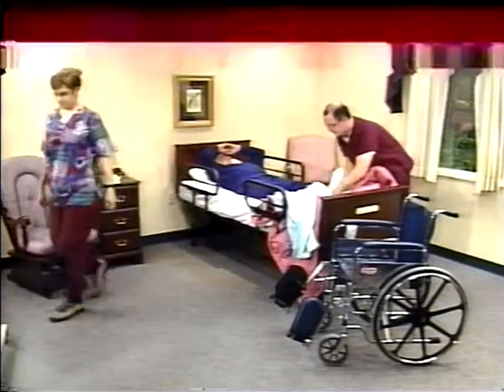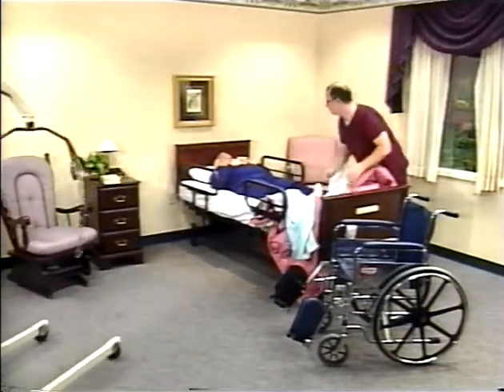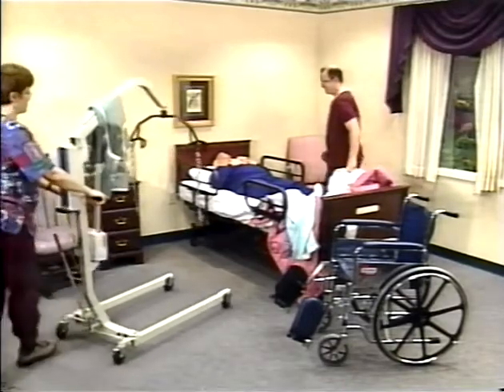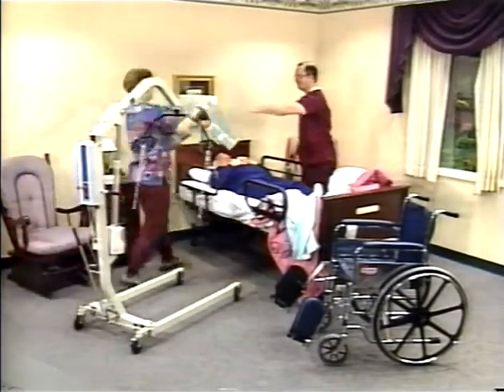Working together, caregivers prepare for the lift. During the lift, one will operate the equipment while the other observes the lift, helps position and reassure the resident, and offers assistance if needed.